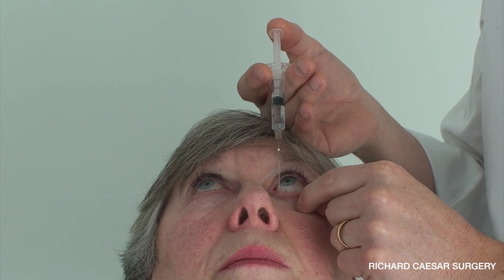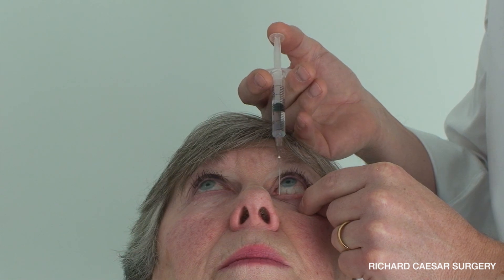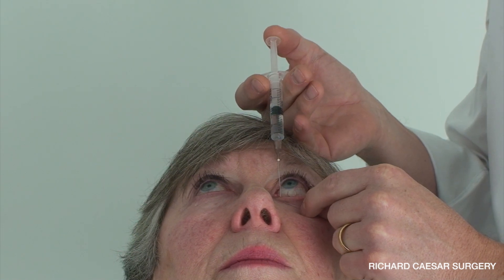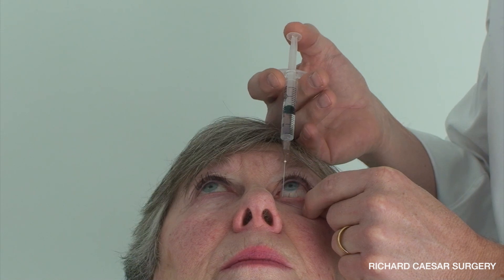This again enables you, with the lid on tension, to descend into the ampulla vertically and then rotate with the tip of the lacrimal cannula around the lower portion of that ampulla, stabilising your hand on the patient's head, and then depress the plunger using your thumb.